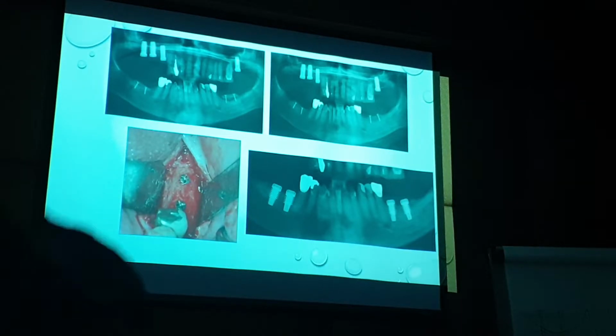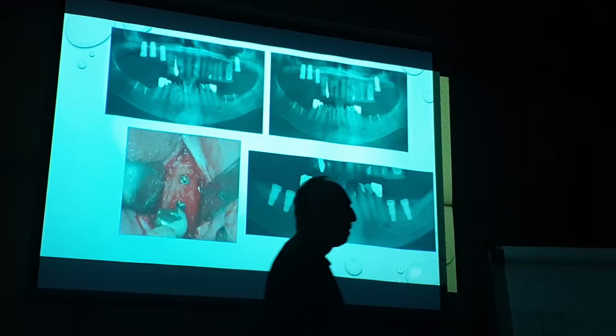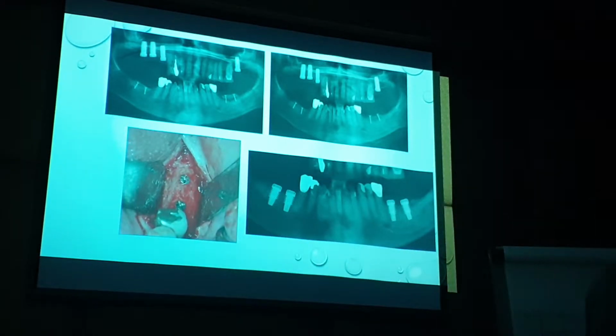Is it possible to create that kind of a contour and then fix a cortical plate? When you say create the contour, you mean ridge. Can you? Yeah, I suppose you could in a particular case, but I let the case decide for me, because I've got all these different possibilities.